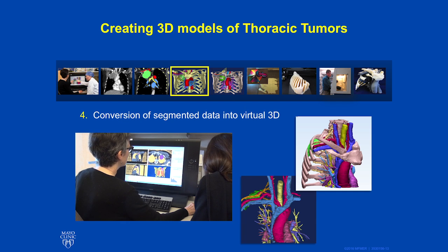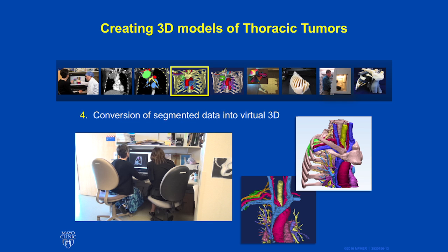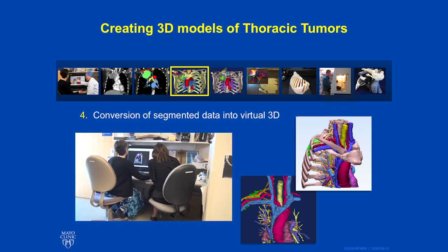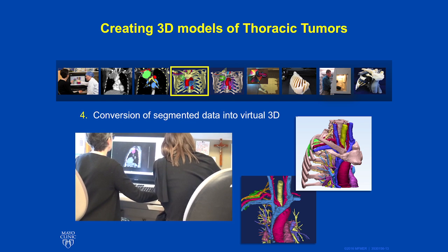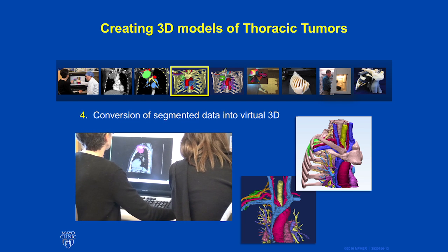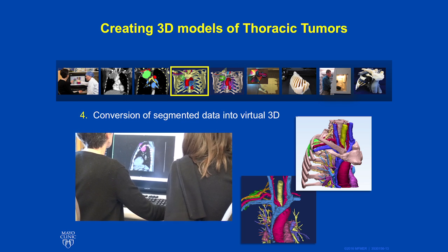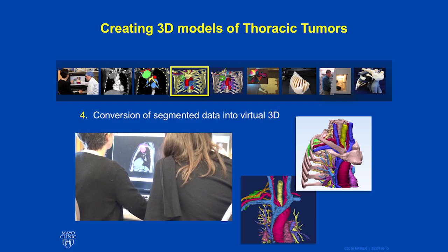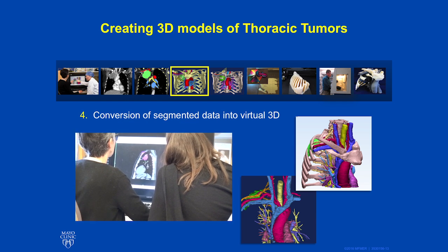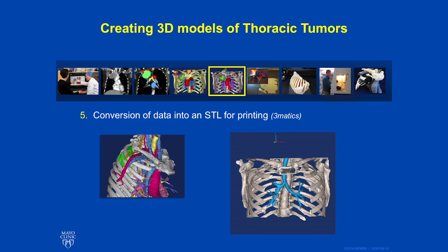Utilizing software that allows automatic reconstruction of three-dimensional images, we can select areas like the tumor, lung, bone, and vascular structures. Masks are created by cropping or outlining the area of interest, making a three-dimensional structure of finer structures within the chest. Separate three-dimensional structures can be fused based on these bony landmarks. Each STL file is a separate color.